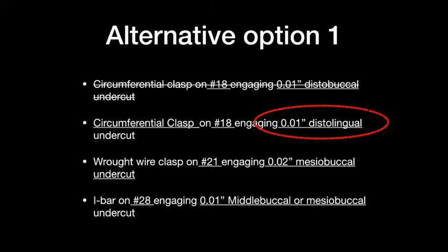However, this is not an ideal design, because think about that. When patients try to remove the removable partial denture out of the mouth, they should grab the retentive arm and dislodge it. If you put a clasp that has undercut on the most posterior tooth and also on the lingual side, it means that your patients need to put their fingers further back in the mouth, close to the throat, to dislodge it.